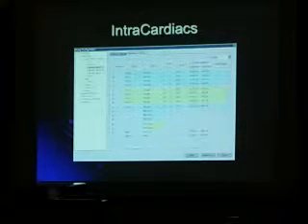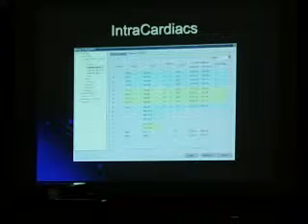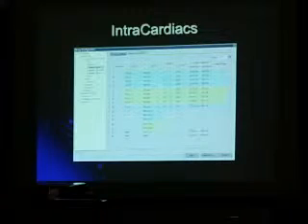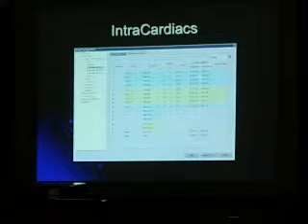Remember how I said most of your signals are running between like 10 hertz, 5 hertz, all the way to about 60 or 80 hertz? So is that anywhere close to 500? We have a setting on our system for 150.